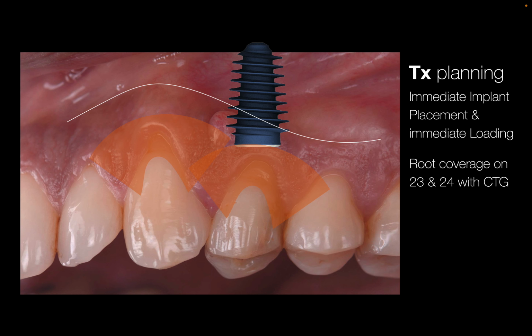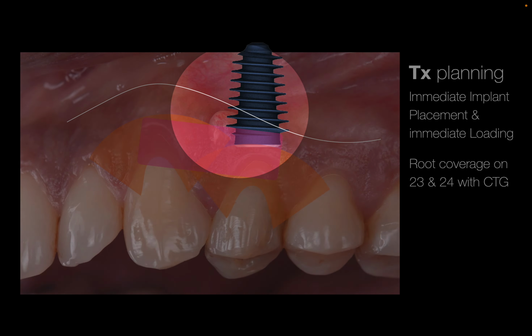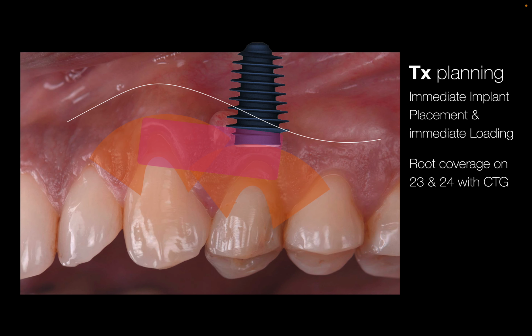And then I'm going to mobilize the same day those gingival tissues to the coronal aspect, and then I'm going to use a connective tissue graft that I'm going to place right on the top of my canine and also on the top of my premolar. That connective tissue will not only serve as a resistant tissue to the relapse, and also to occupy a volume to give extra volume to your surgical site, but also is going to cover that drainage, which will help the soft tissues to close and isolate the problem from the inside, from the outside.